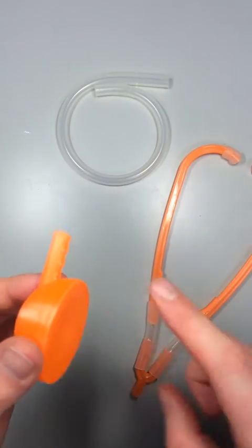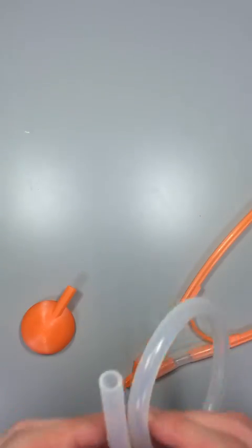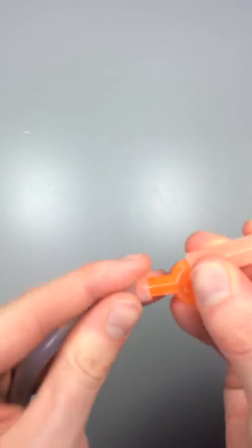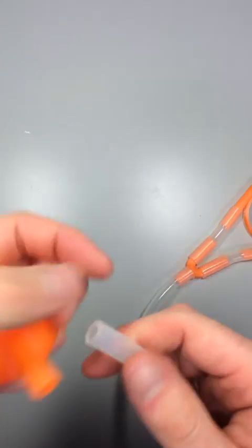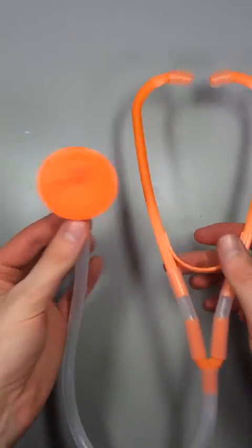The last piece is the stethoscope and the bottom of the U-shaped joiner. This is using the longer piece here. One end goes into the bottom here — just slide it up — and then finally, into the stethoscope. And there you have your full stethoscope.